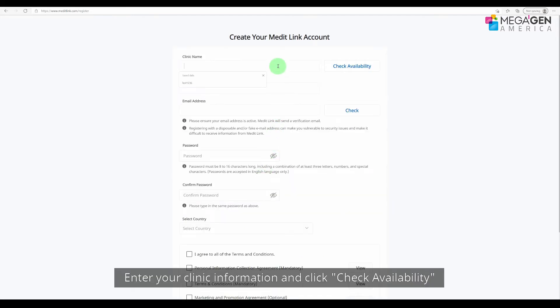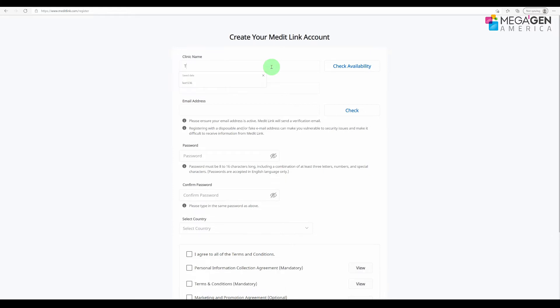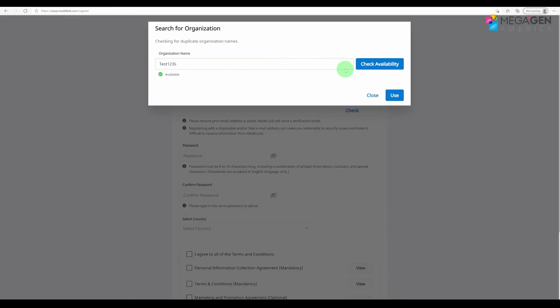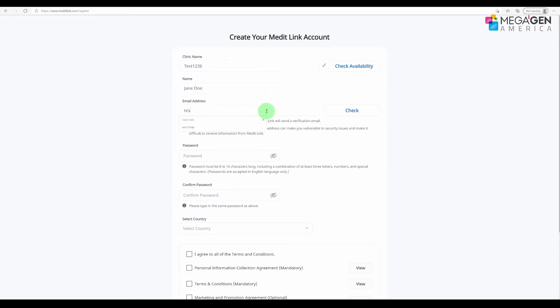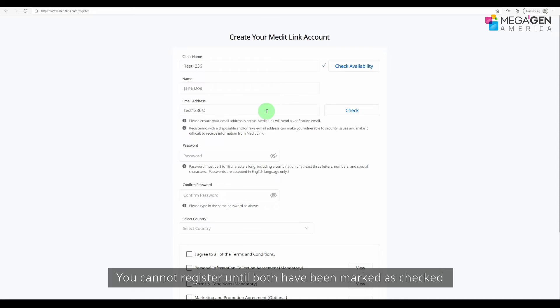Enter your clinic information and click 'Check Availability.' Then enter your name and email address, and click 'Check.' You cannot register until both have been marked as checked.